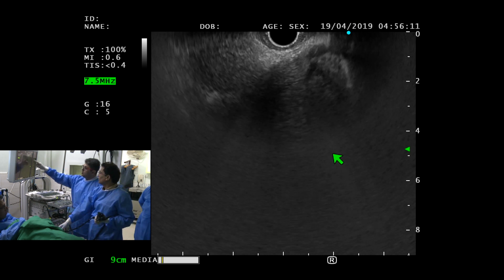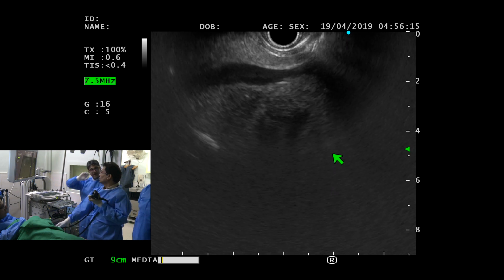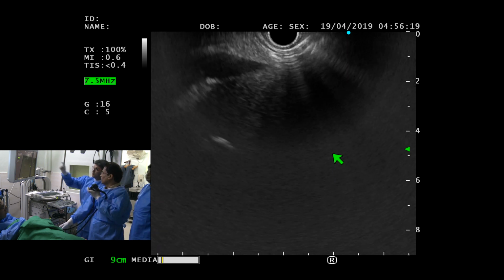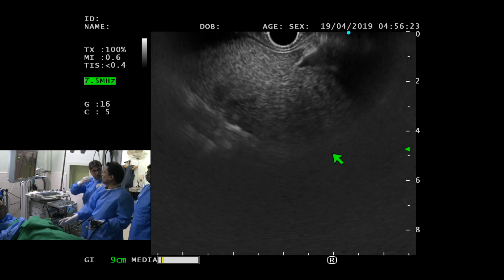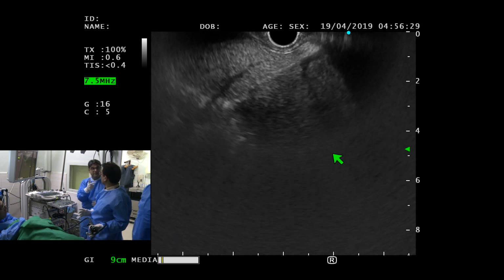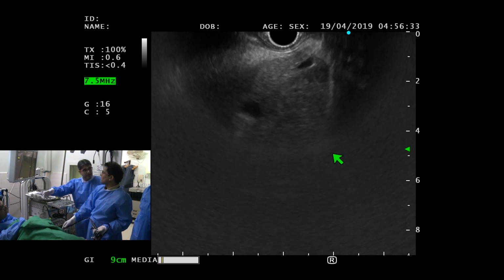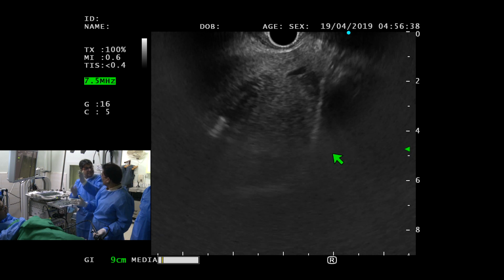And we know that the next stop of this train journey we are doing is the aorta, which is our first guiding structure. But before we go to the aorta, there's a small mid station that will reassure us that our plane is still in which is hepatic and IVC. Okay. That means our scope has not been pushed or pulled, our plane of reaching is at the same level.